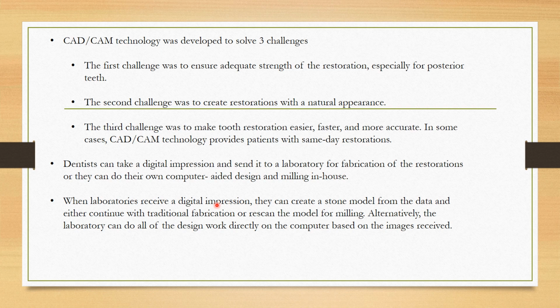Coming to the three major challenges which can be faced. One is to acquire the adequate strength of the restoration, especially the posterior teeth. The second is the creation of restoration with a natural appearance. And thirdly, to make tooth restoration easier, faster, and more accurate. So these are the challenges which are solved by the CAD-CAM. We have used CAD-CAM for our benefit to help in all three challenges.